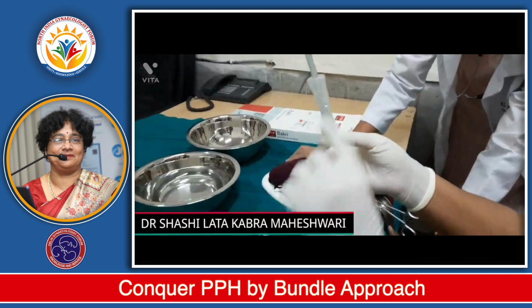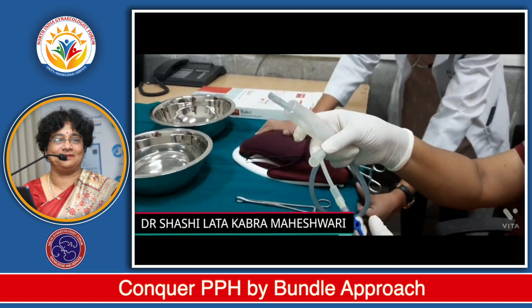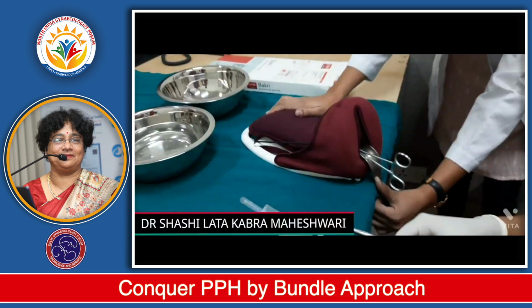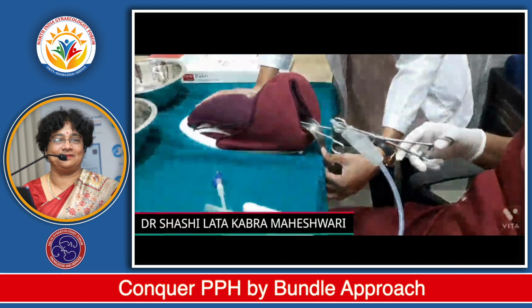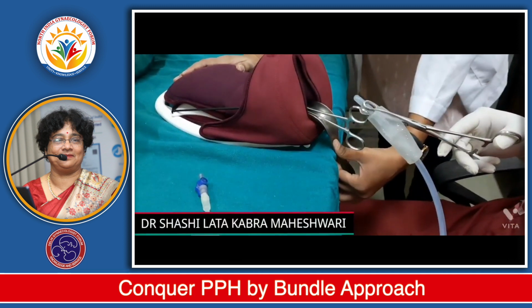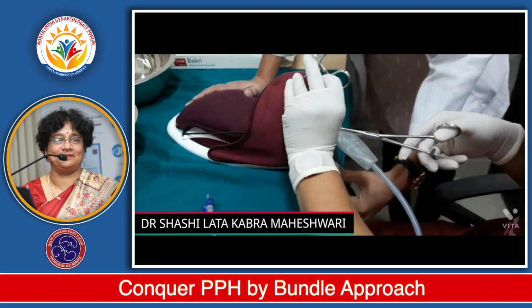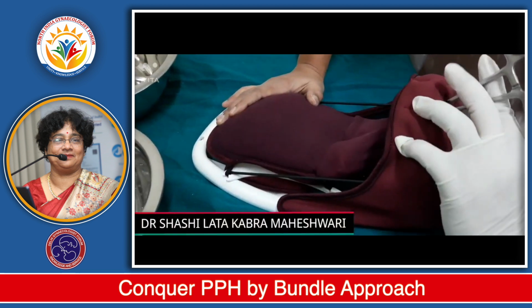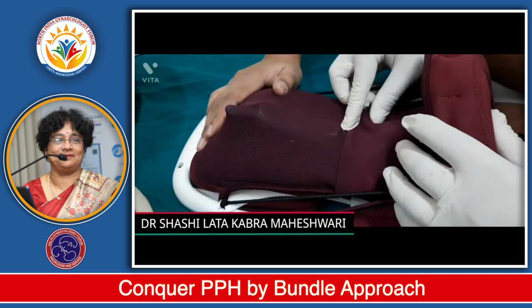This is Bakri balloon. It has a bulb like this. It is made of silicone, and this is one channel for the outflow, and this is one channel for the infusion or attachment of the fluid. With another sponge holder, we will hold it at the tip and gradually introduce it. It can be inserted either with the help of the sponge holder or with the hand directly. Here I am retracting the cervix a little bit, and now I will insert the balloon. We must take care that the lower part of the balloon is above the cervix, the internal os of the cervix.